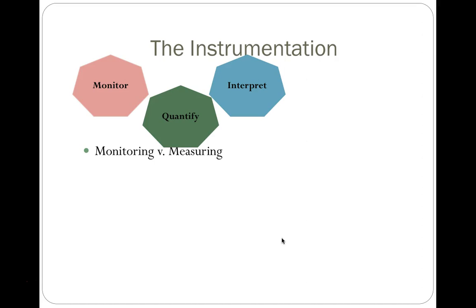Measuring the activity involves placing it on an objective scale, so that the monitored readout would actually have a scale where 5 means something on this scale, and a drop to 4 or a rise to 6 are equally spaced. So the scale on a biofeedback unit may use the number of microvolts. It might be a simple 0 to 10. It might be a bar graph, or another representation of the measure.